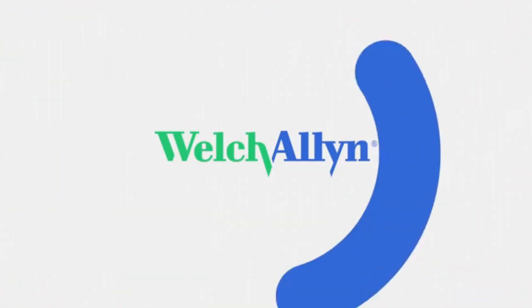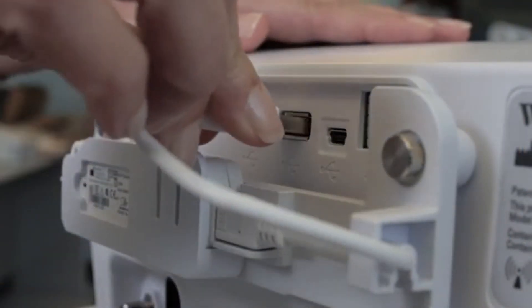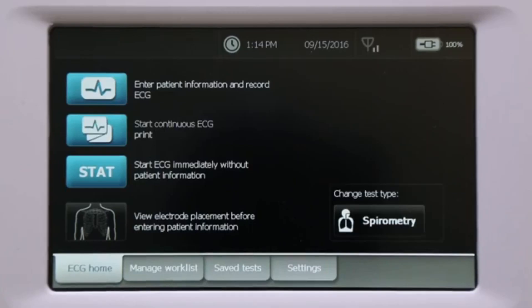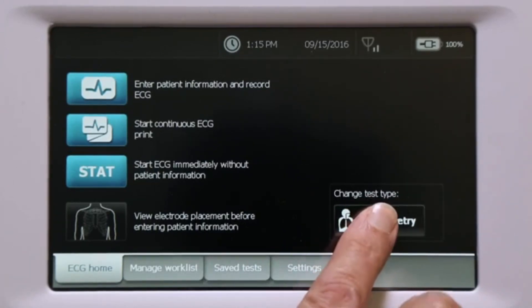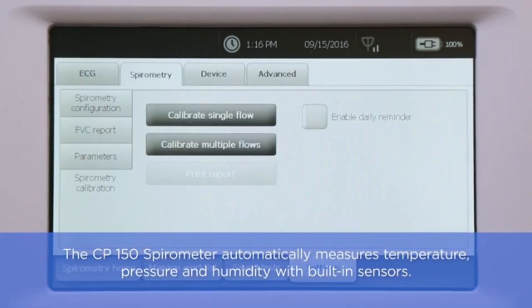Spirometry is a plug-and-play optional feature which can be added to the CP150 at time of purchase or afterwards. Once the spirometer is plugged into the USB port, the spirometry button automatically appears on the home screen. Touch the spirometry button to open the spirometry home screen, with options to perform a new test, continue a test, or calibrate the spirometer.